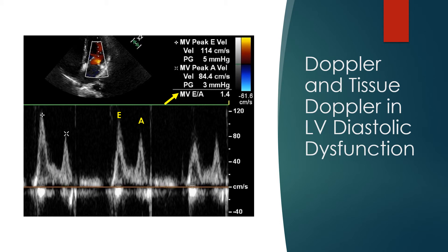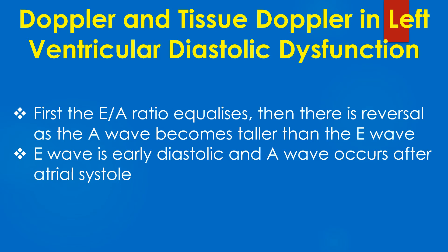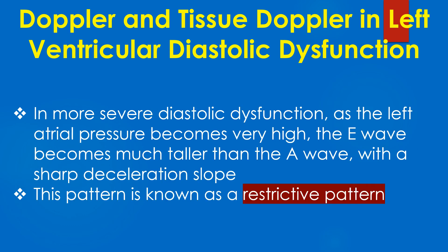Though the E by E prime ratio is increased in this case, there is no E by A reversal, which is the more commonly used indicator of LV diastolic dysfunction. When the E by A ratio is used, there could be several grades of LV diastolic dysfunction. First, the E by A ratio equalises. Then there is reversal as the A wave becomes taller than the E wave. E wave is early diastolic and A wave occurs after atrial systole. In more severe diastolic dysfunction, as the left atrial pressure becomes very high, the E wave becomes much taller than the A wave with a sharp deceleration slope. This pattern is known as the restrictive pattern.